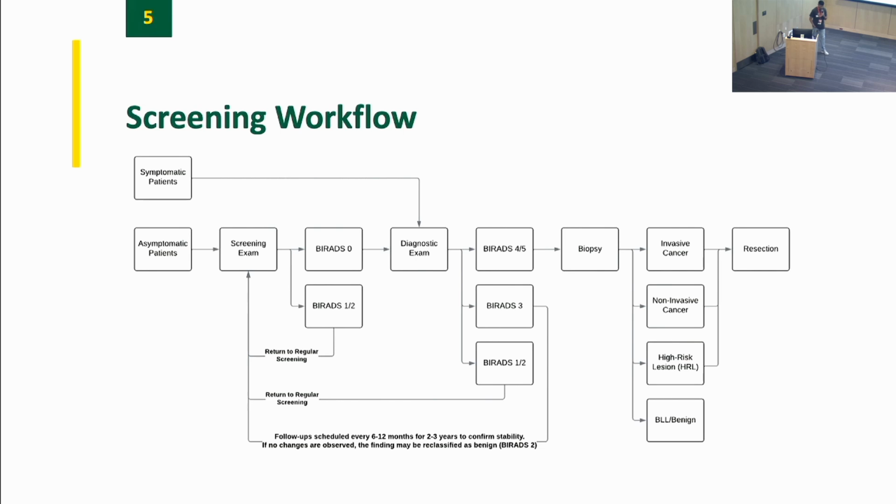That's a great question. We will talk about this over the next couple days. We're going to talk a little bit about MRI on Thursday. So the question was, are there women that, after their BI-RADS 0 on screening, instead of going to diagnostic mammogram, go to diagnostic ultrasound? And the answer is yes.